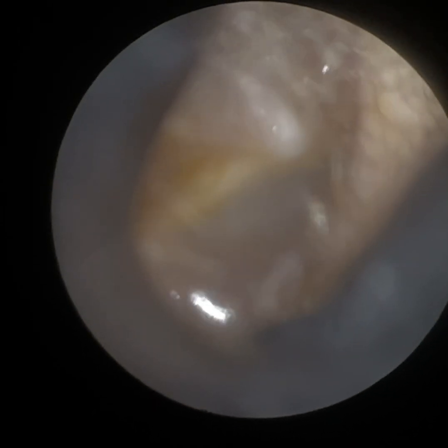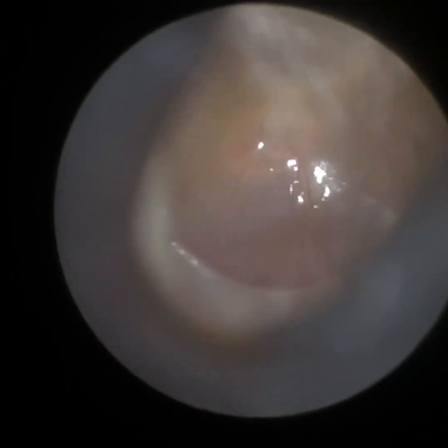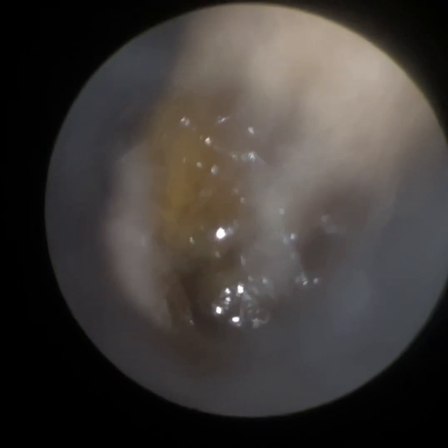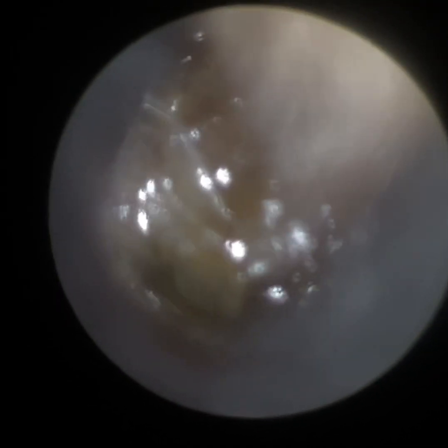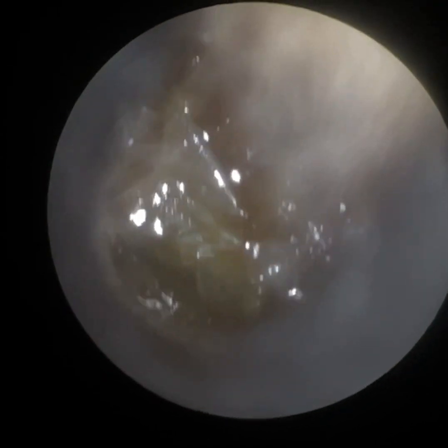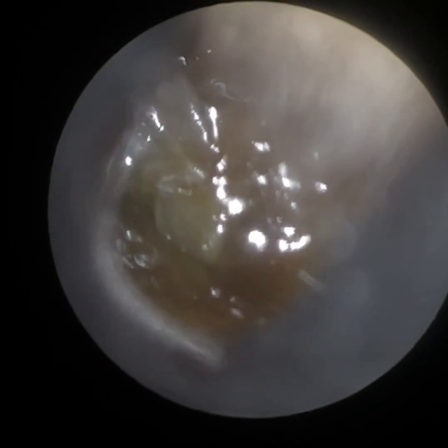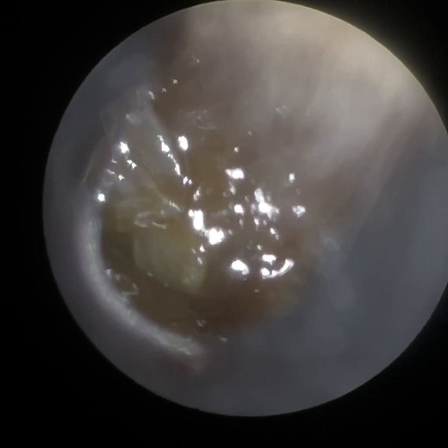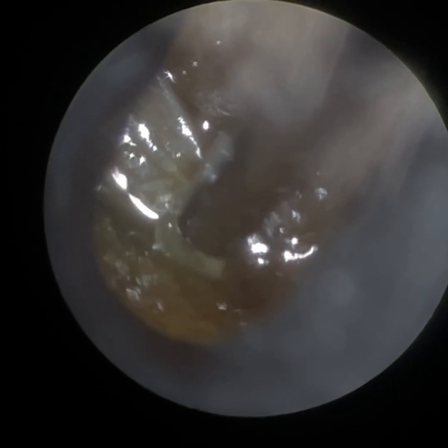We're now just going to move on to the patient's left ear. In the left ear, there was no polystyrene piece, fortunately, but there was impacted wax. The child's mother had been using cotton buds — she did explain that she did. So just giving some general ear care advice: stay away from cotton buds. They further impact wax and they can cause trauma. And in fact, in this ear, once I've removed this wax off the eardrum, there is a slight bruise posteriorly on the eardrum itself.